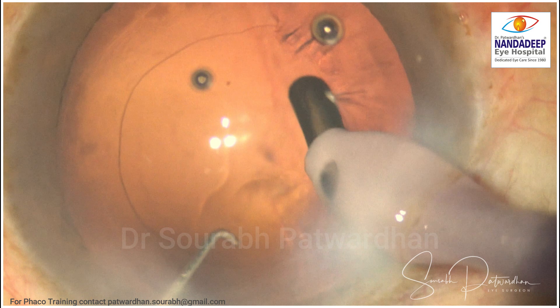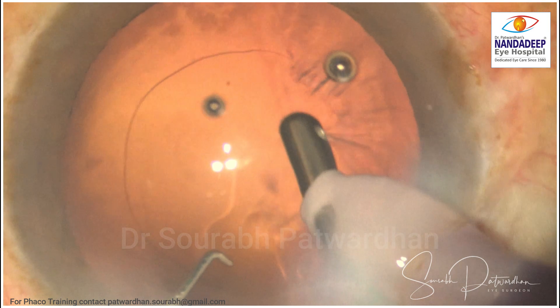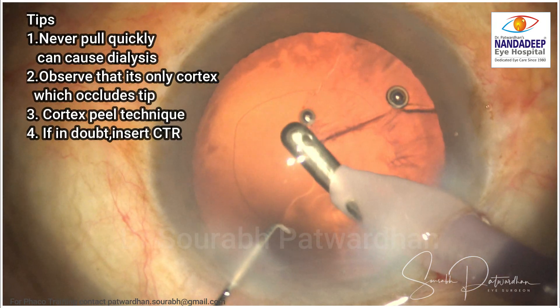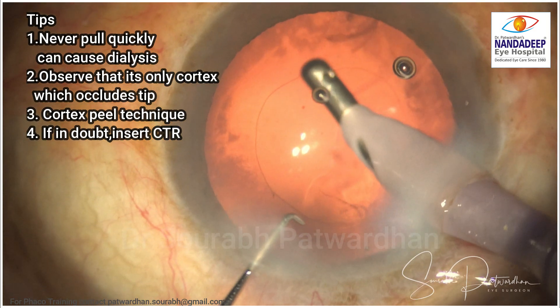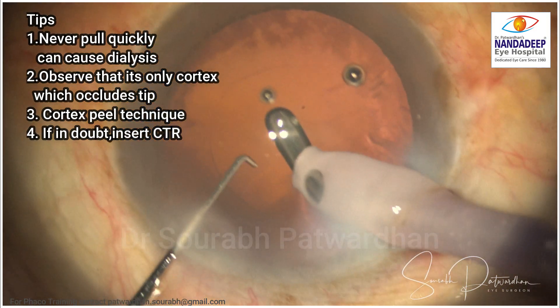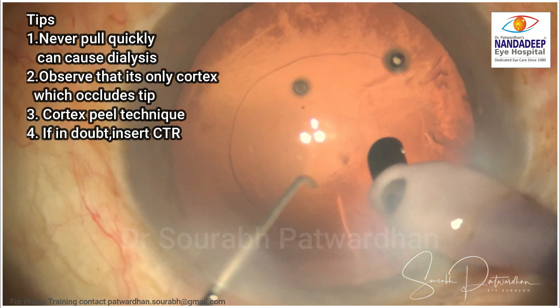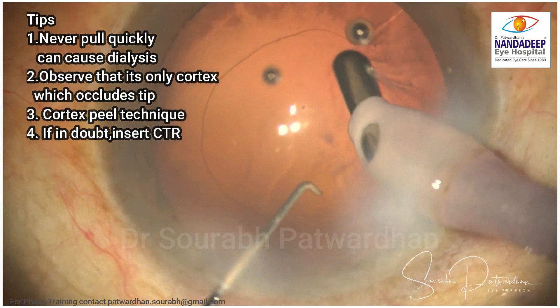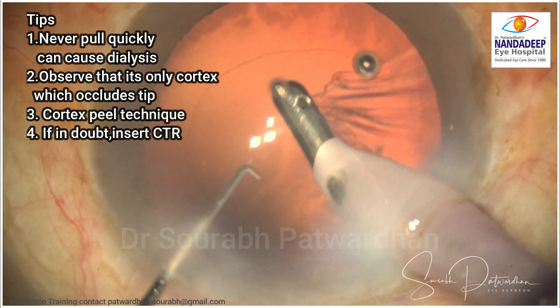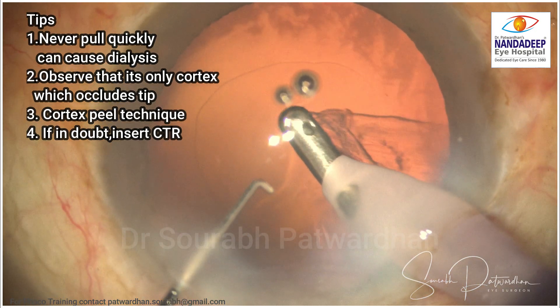If we engage the anterior capsule rim and pull it, this will get converted into a frank zonular dialysis. But you can see the posterior zonules are giving good support. So never pull quickly in such cases because it can cause dialysis or peripheral tears. Observe that it is only the cortex which occludes the tip and use this cortex peel technique — use low vacuum, maybe 100 to 150, and try to peel off the cortex gradually making sure you are not holding the anterior capsule. Of course if you feel the weakness is quite severe you can put a CTR and then remove the cortex.